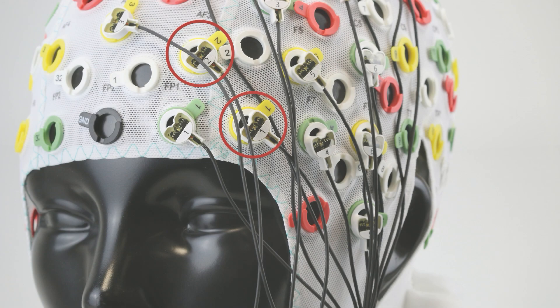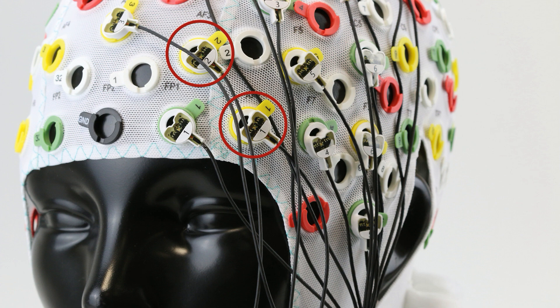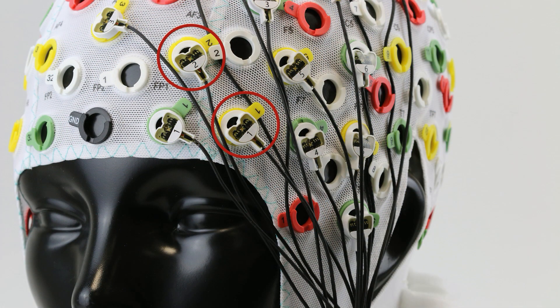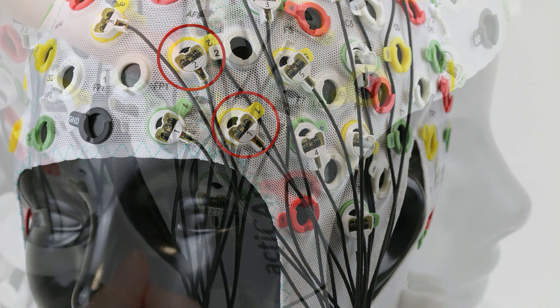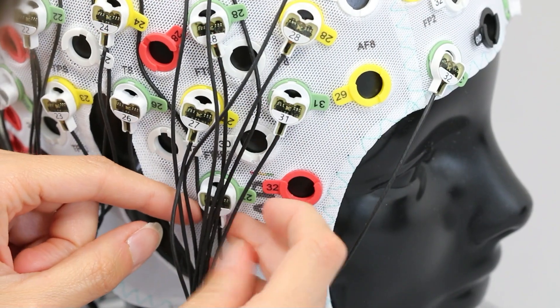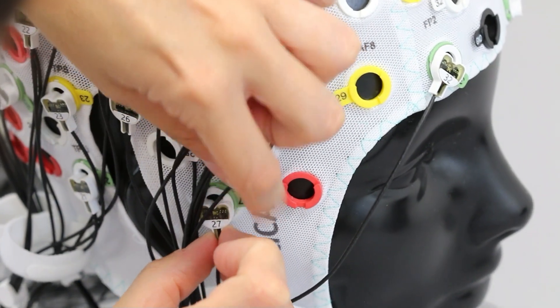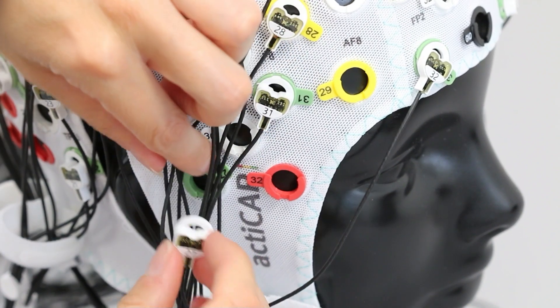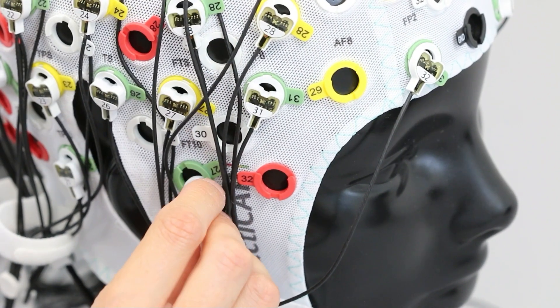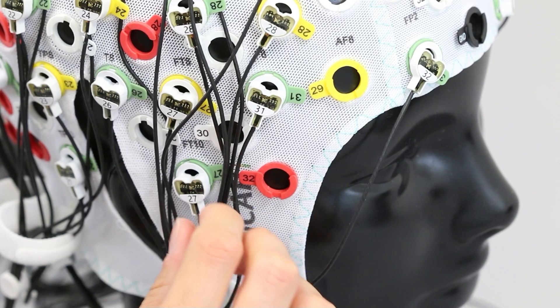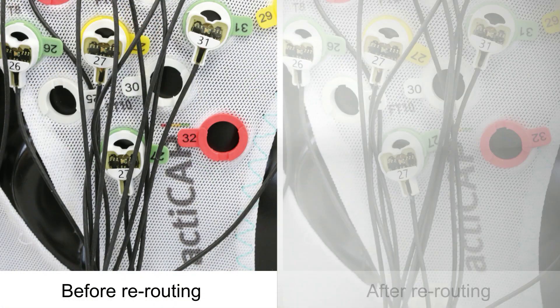Continuously adjust lead wires routing, especially when inserting electrodes in previously populated cap quadrants. For example, reroute the lead wires of electrodes located in the lower part of the cap on top of cables of higher electrodes since this will keep them fixed and stable. Repeat this step as many times as needed.